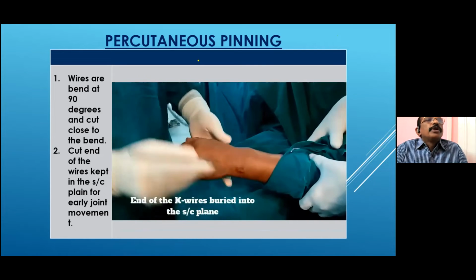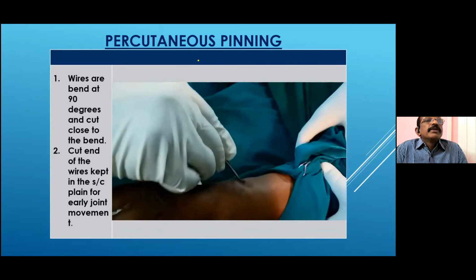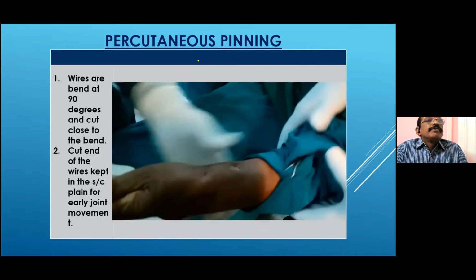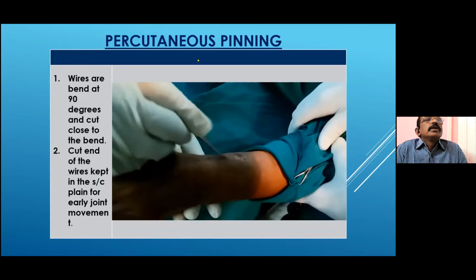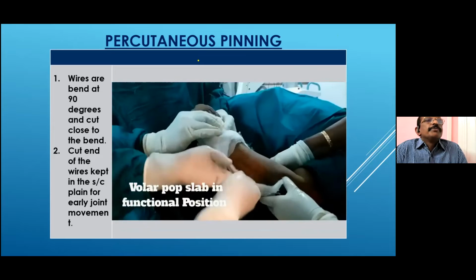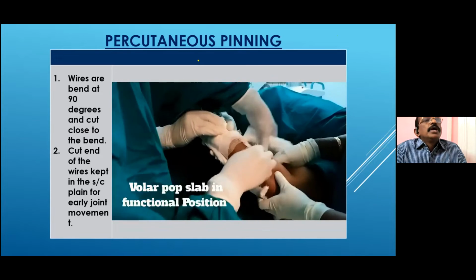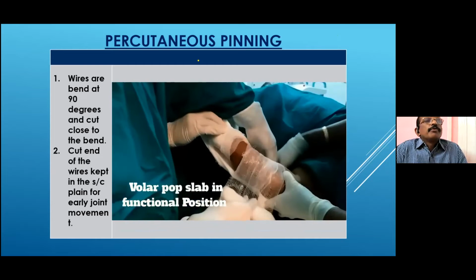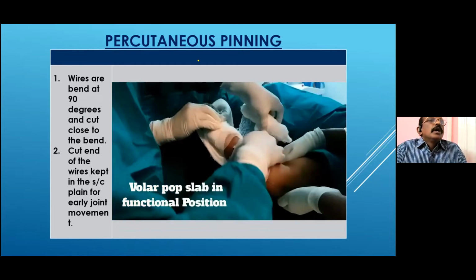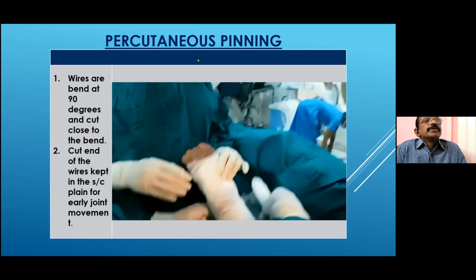After that, we can pull the skin with a thumb forceps so that nothing will be seen outside. Usually the end of this wire will interfere with the wrist joint movement, but here it is not interfering with this. If there is a severe comminution, we are giving a POP slab, and if it is a little bit small comminution, we can give this wrist splint.